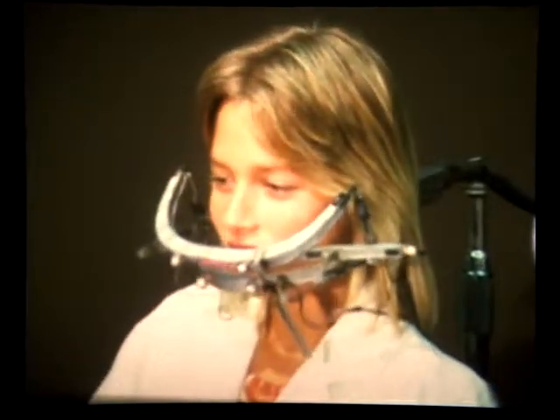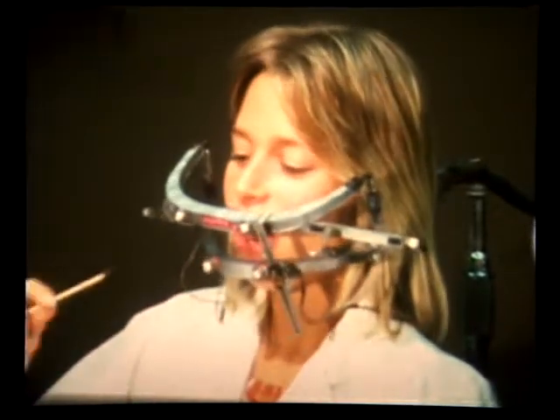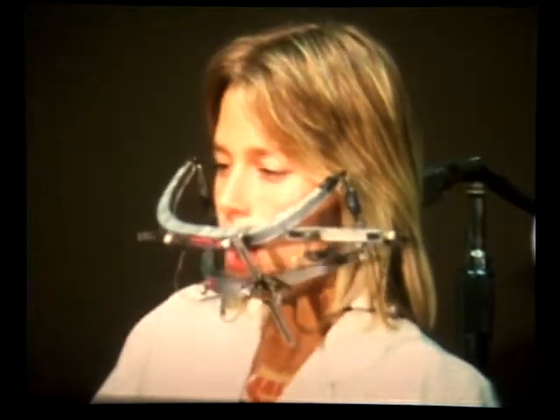A variety of food consistencies were tested. Here the subject is chewing raisins. The only instructions given the subject during the test was to chew the food on one side, then alternate and chew the food on the opposite side.